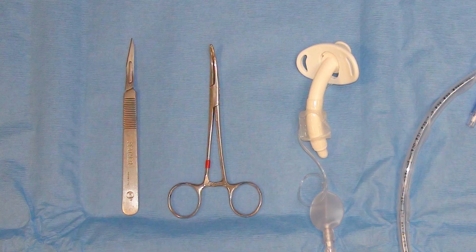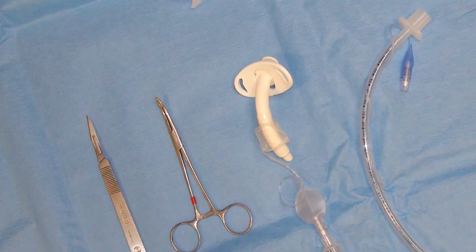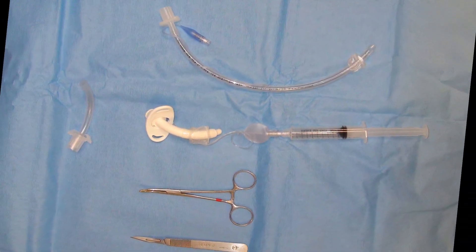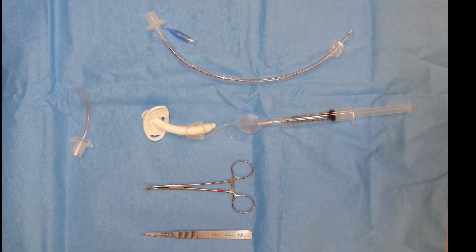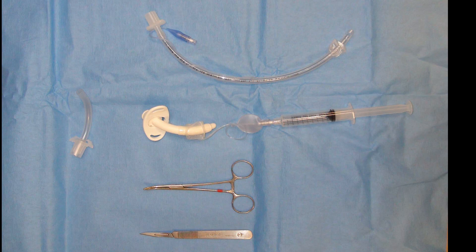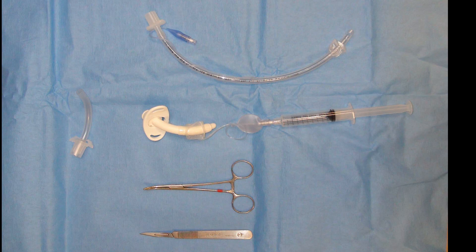In terms of required equipment: a number 11 blade; an airway in the form of either an endotracheal tube or a Shiley tracheostomy, varying sizes from 4 to 8-0; and a 10cc syringe to allow for adequate cuff inflation.